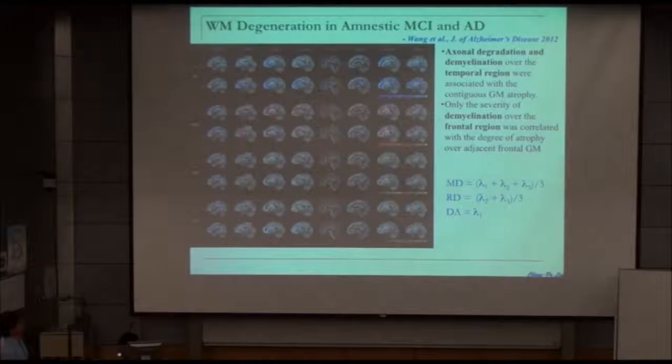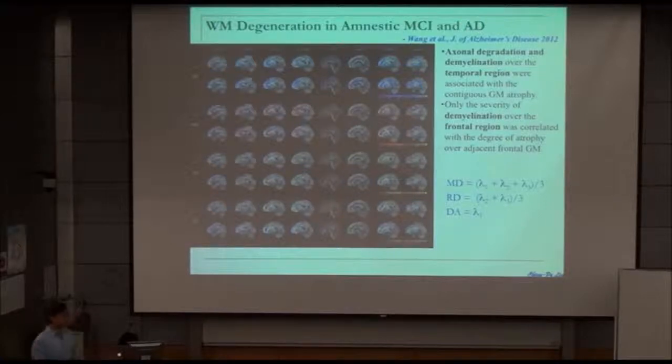And here is another example where we study patients with Alzheimer's and also mild cognitive impairment. We want to know how the brain changes in gray and white matter. So we combine both techniques, as I introduced at the very beginning: the T1 anatomy measurement and the white matter measurement. We want to know the progression of the structures in white matter and gray matter.